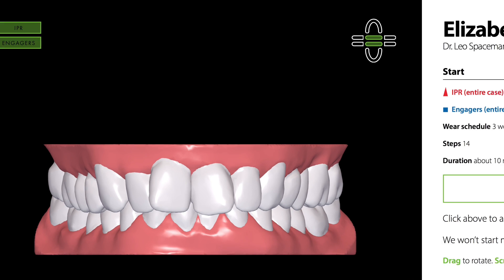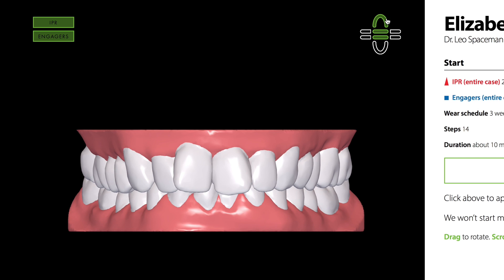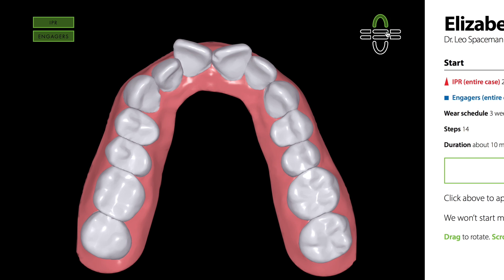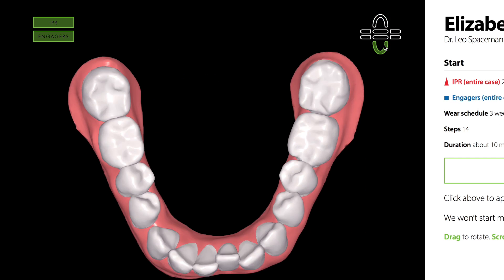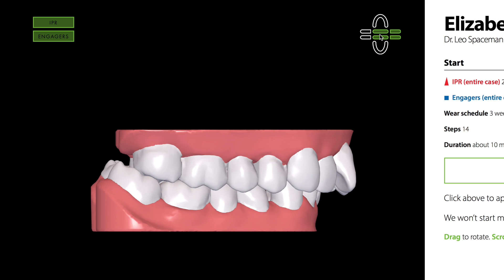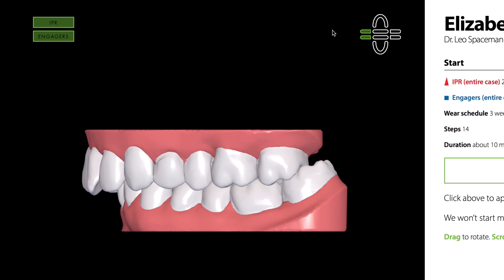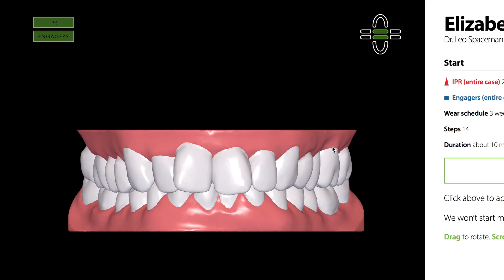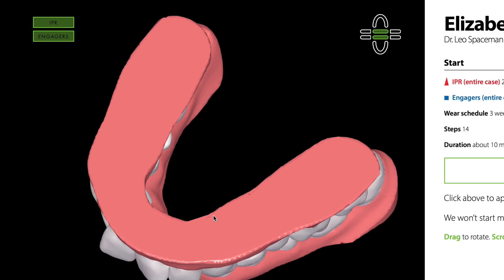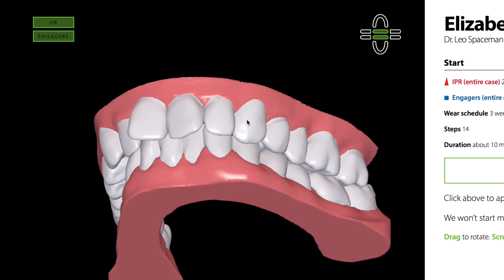Shortcuts are available for the most common viewing angles: upper occlusal, lower occlusal, right, front, and left. You can also rotate the model to view the teeth from any angle by clicking and dragging.